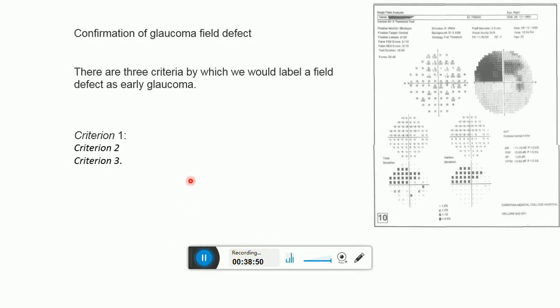In the clinical context, if the clinical features strongly indicate glaucoma, such as raised IOP and a suspicious disc with glaucomatous features, even one criteria is good enough to make a diagnosis. On the other hand, if the clinical features are not suspicious at all, with normal IOP and a healthy neuroretinal rim that maintains the ISNT rule, all 3 criteria must be positive before one even begins to consider a diagnosis. Also, we would repeat the field and go back to look at clinical features, especially the disc, before making a diagnosis.